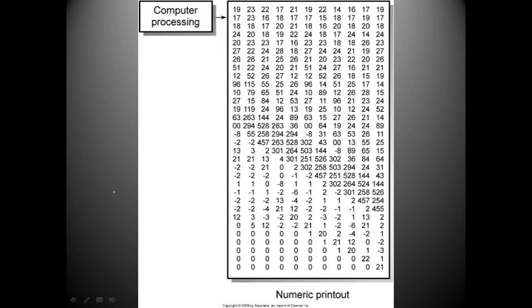And so here we have what an actual printout of the image looks like. As you can see, you have all different numbers. We have some that are less dense, residing in this area. Then we have some in this area that are really dense.